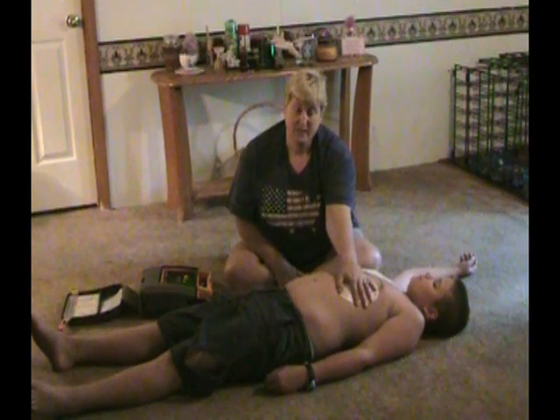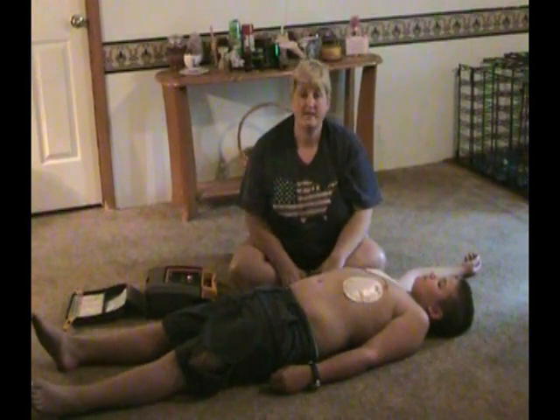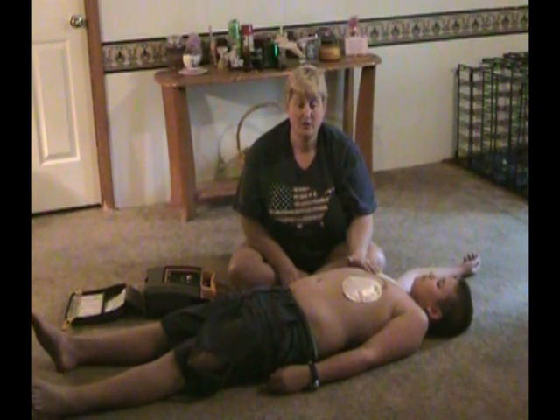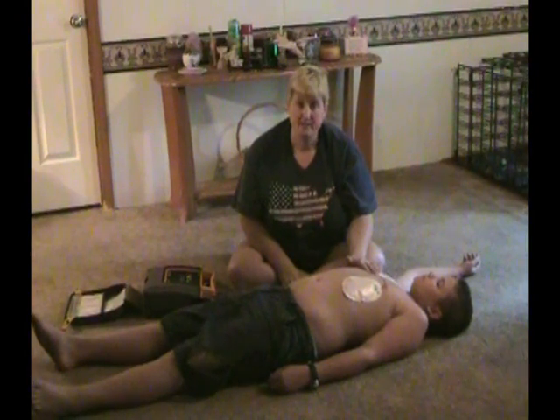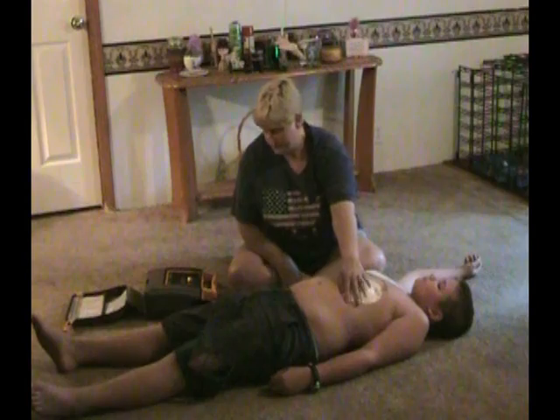There are child-sized pads that some AEDs come with, which is great. If you don't have any child-sized pads, you can use adult pads on children. Do not use child pads on adults. They will not be effective. For infants 1 year or less, the AED is not recommended.